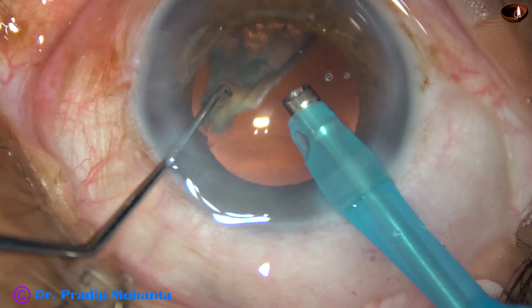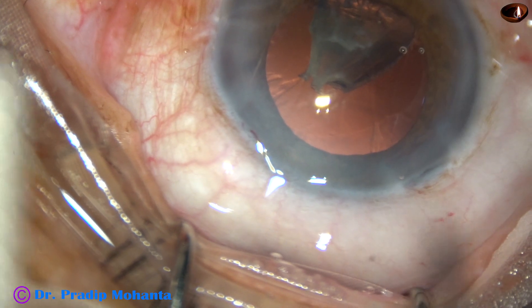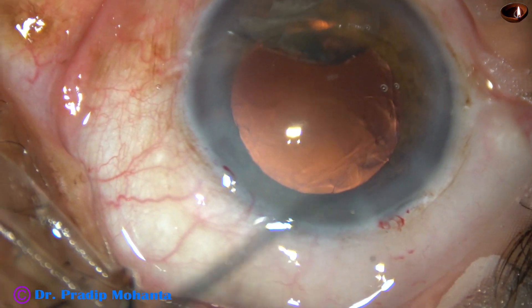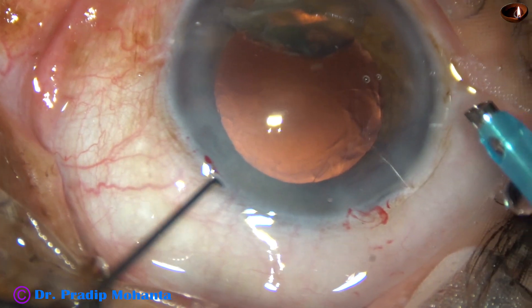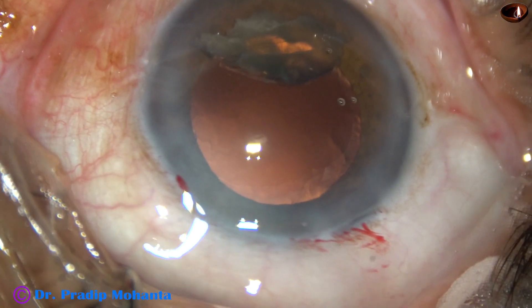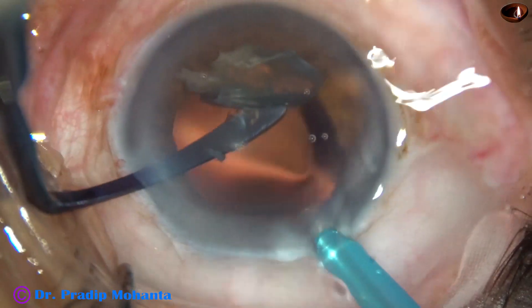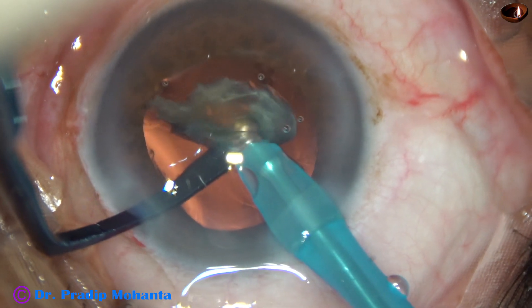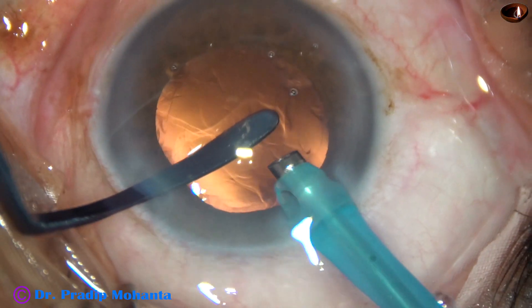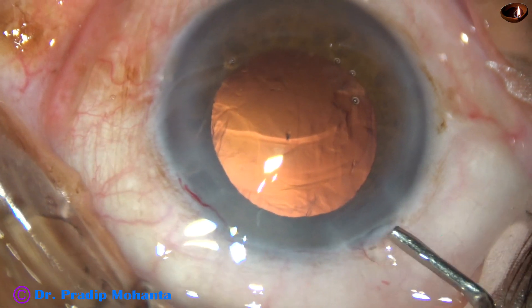In this case, you can see that the posterior capsule is not covered by any epinuclear sheet. So to protect the posterior capsule, I am going to take an instrument which I call the posterior capsule protector. This instrument has been devised by me. It is a thick instrument that goes into the side port of about 1.5 millimeter. And over this posterior capsule protector, each piece is emulsified. Emulsification of the pieces has been done.